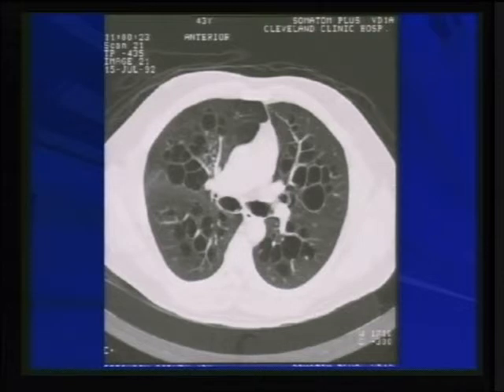And what happens is sometimes when the bronchi become dilated, especially in a cystic manner, they can mimic diffuse cystic disease. But there is another clue here, is the fact that there is tracheobronchomegaly, but mainly here bronchomegaly. So this is actually Mounier-Kuhn disease, where patients with tracheobronchomegaly have disruption and congenital absence of the cartilage in the first and second orders of the bronchi, and that's why you have this cystic dilatation, and most of them are going to be congenital conditions.